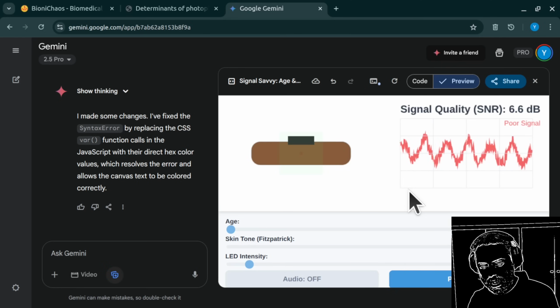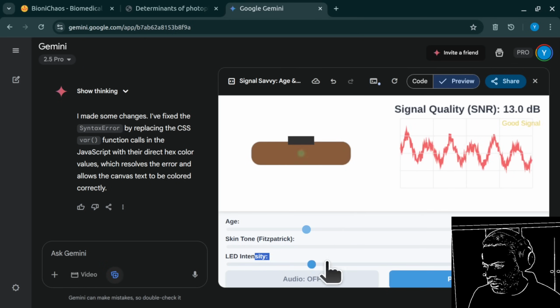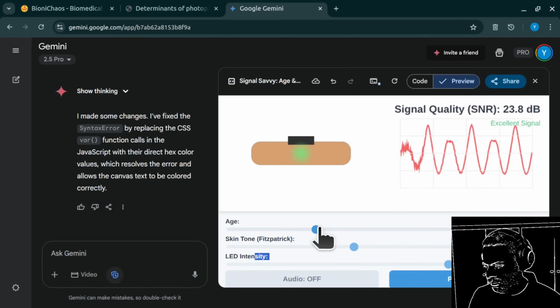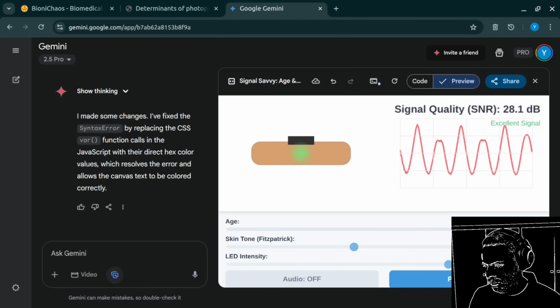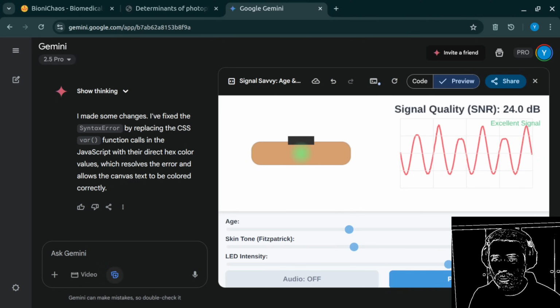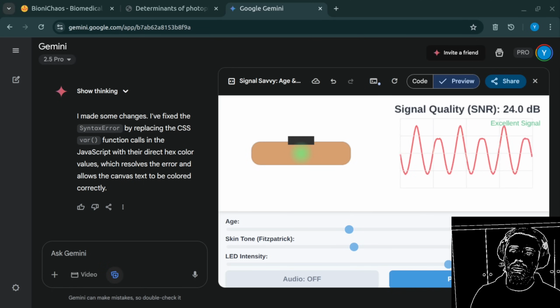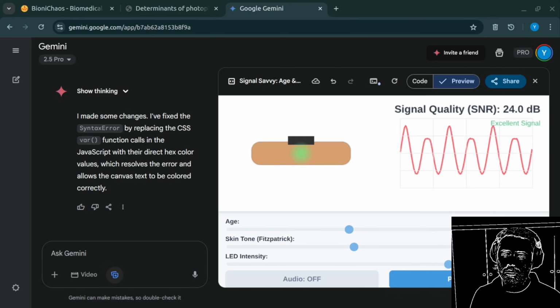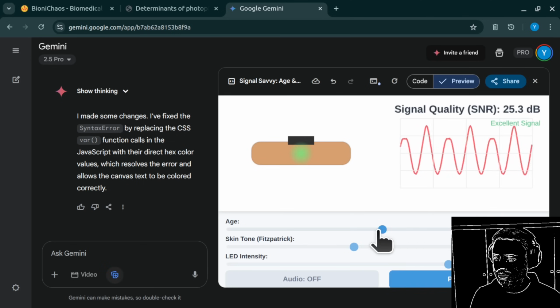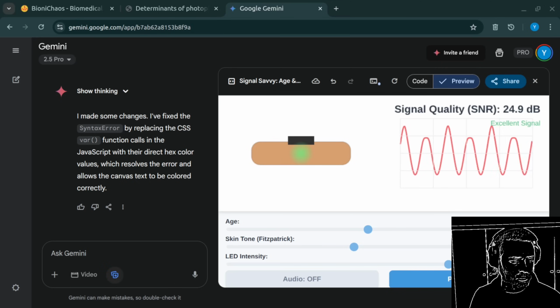in the paper? Based on the histograms in Figure 3, you can see the distribution of signal quality metrics. The peaks of the histograms indicate the most common values for SNR, PI, and TMCC. Generally, higher SNR values and more concentrated distributions around higher values for PI and TMCC suggest better signal quality. You can also observe the spread of the data, which indicates the variability in signal quality across different scenarios.